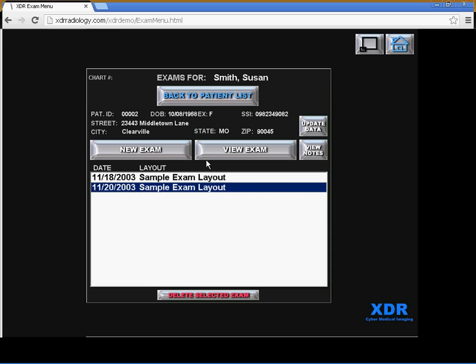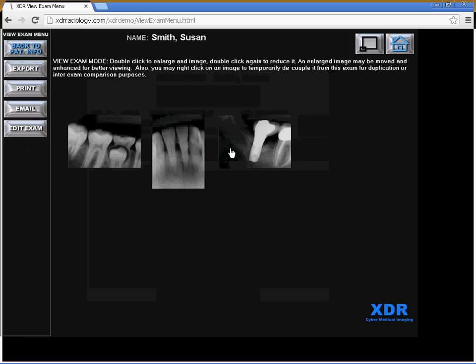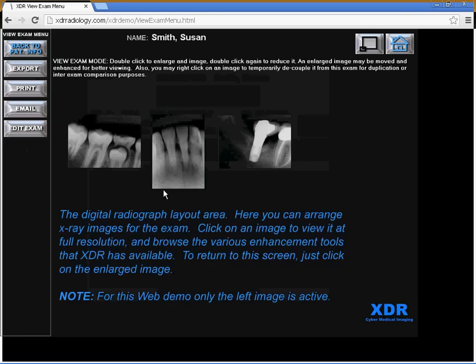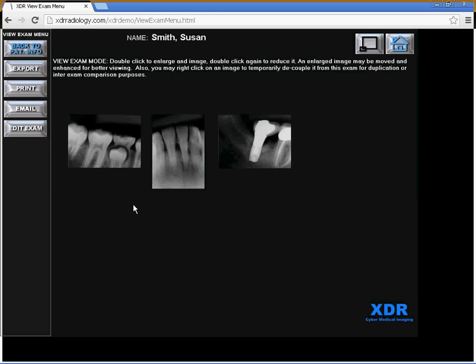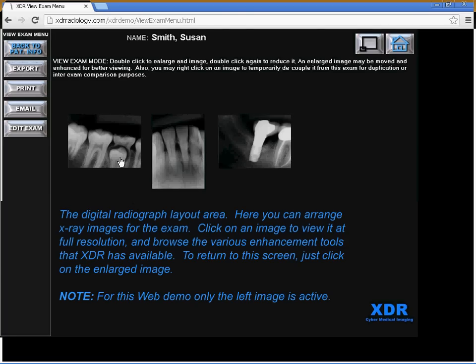If you were to click View Exam, it will show the digital radiograph layout area where we are pointing to now, where you may arrange x-rays for the exam.